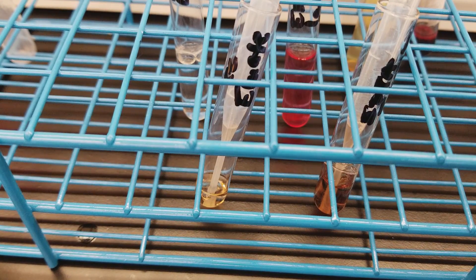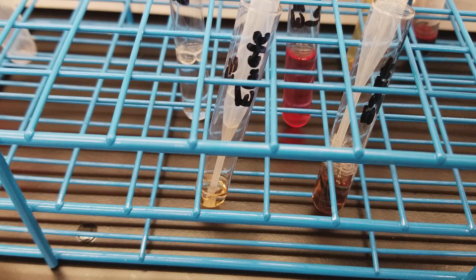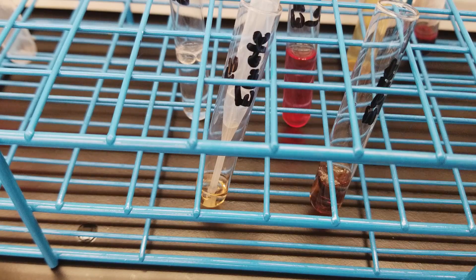That is going to hopefully bring the pH up to between 6.4 and 7.6, because blood is supposed to be at a pH of 7.4. So we're going to do the one with the larger amount first, since that's pretty much on the nose of the procedure we've been working with. We're going to take 1 mL of the buffer solution and add it to the eluate.